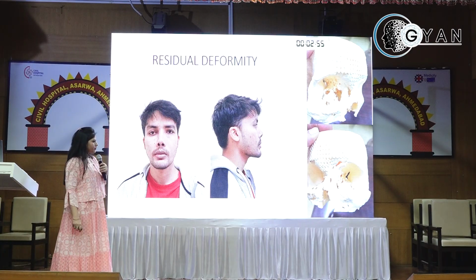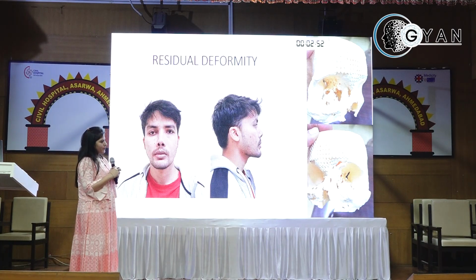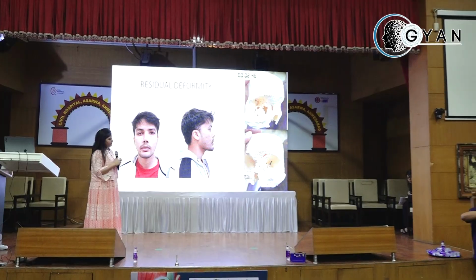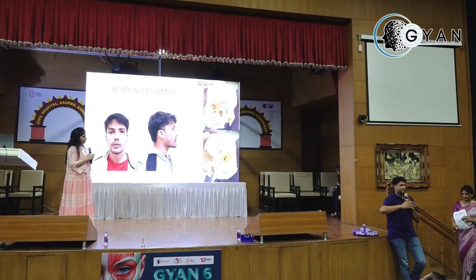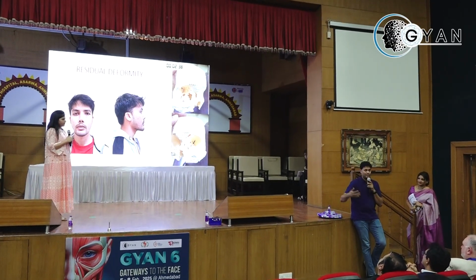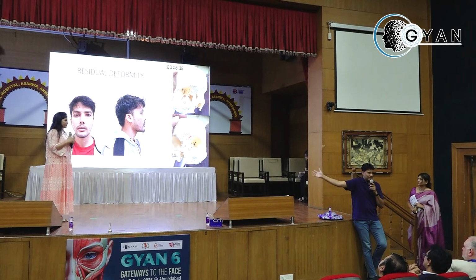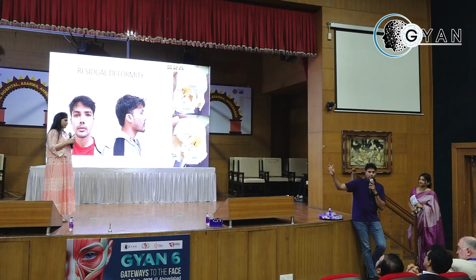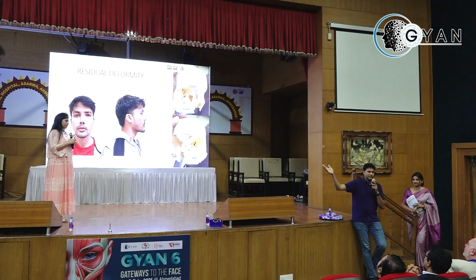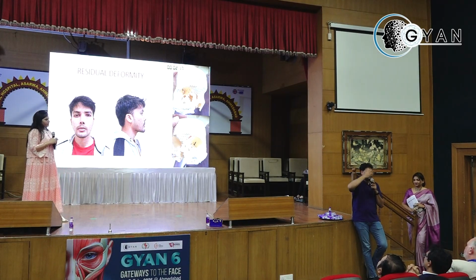So I'll give you a tip on approaching anything where there is a cranioplasty, and this is something that we need to know. When you are raising the scalp flap, you can get the scalp thicker or thinner. If you need the pericranium for some purpose, you end up making the scalp flap slightly thinner. But if you don't need the pericranium, obviously in this case they might have violated it because they've entered twice, you want the scalp flap to be thicker. So almost always err on the side of going almost to the bone when you are raising the flap, because you don't want to thin it out. The thinner the scalp flap, the more the metal, or whatever you put in, will be visible or palpable.